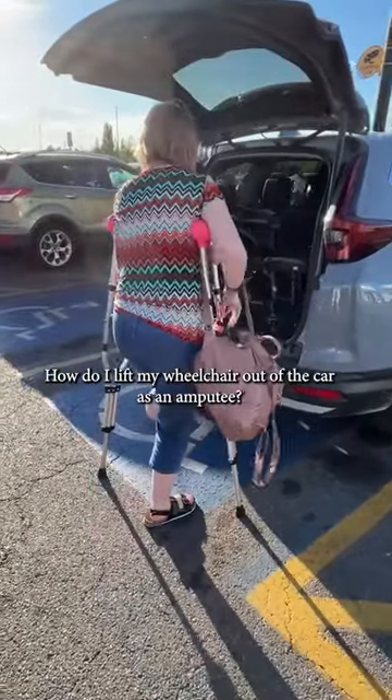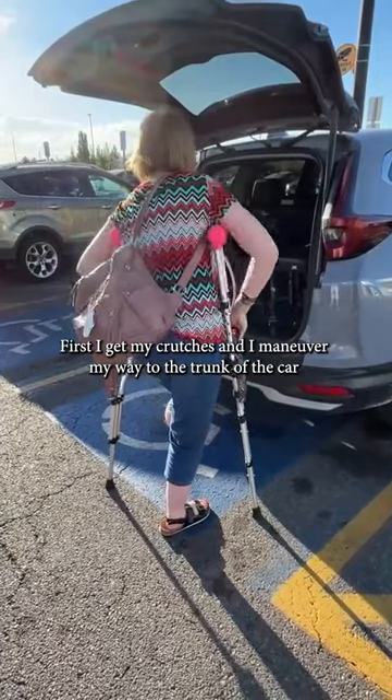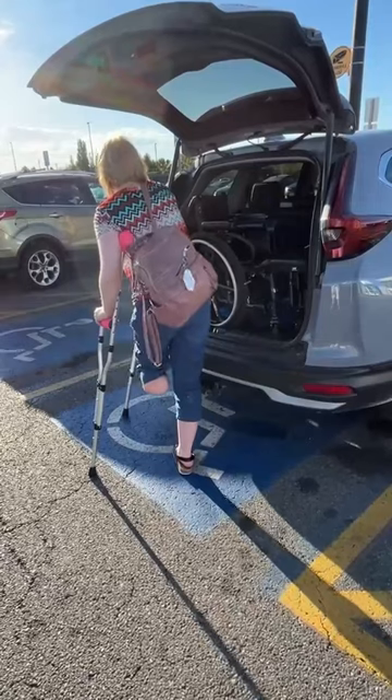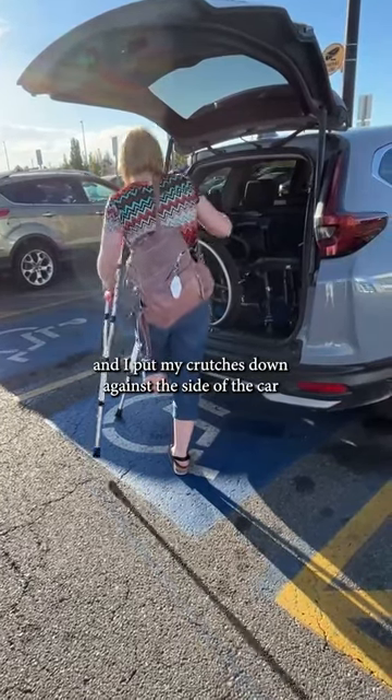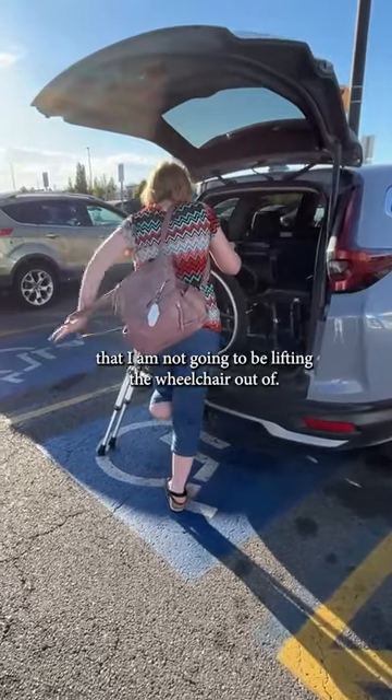How do I lift my wheelchair out of the car as an amputee? First I get my crutches and I maneuver my way to the trunk of the car, and I put my crutches down against the side of the car that I am not going to be lifting the wheelchair out of.